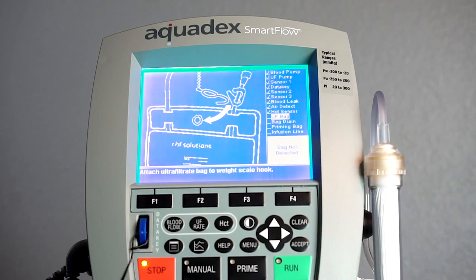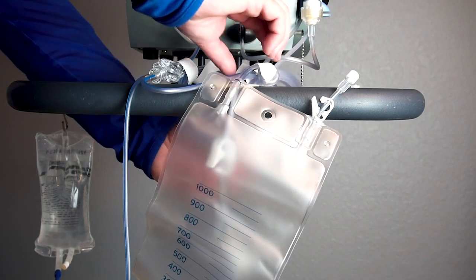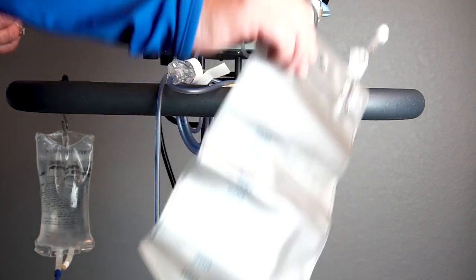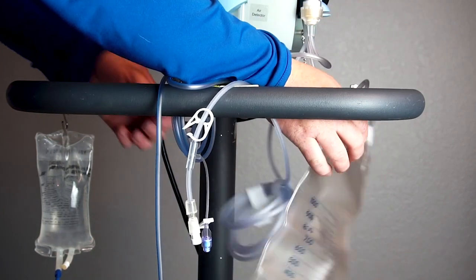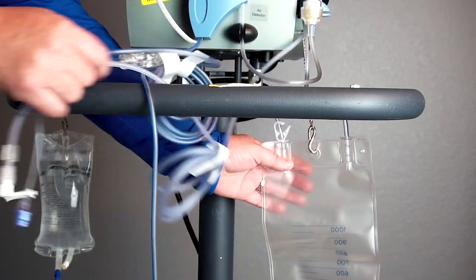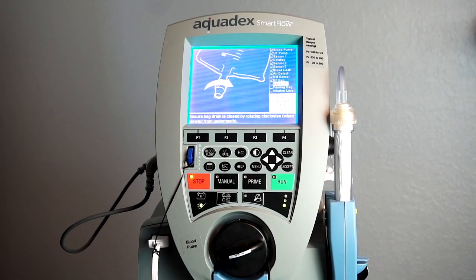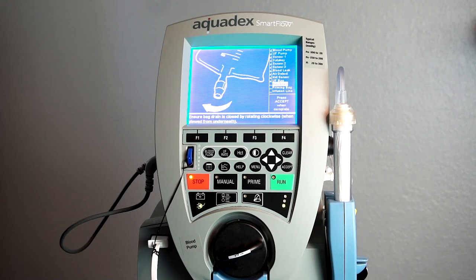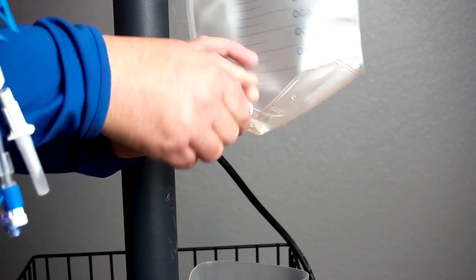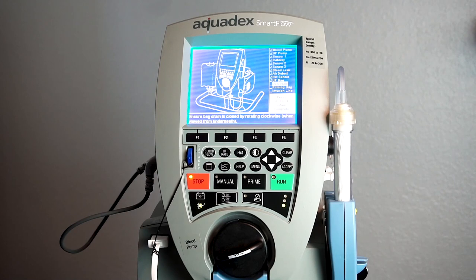Next, attach the ultrafiltrate bag to the weight scale hook underneath the UF pump. Ensure that the bag is able to hang freely. Ensure that the bag drain is closed by rotating clockwise when viewed from underneath. Press accept when complete.